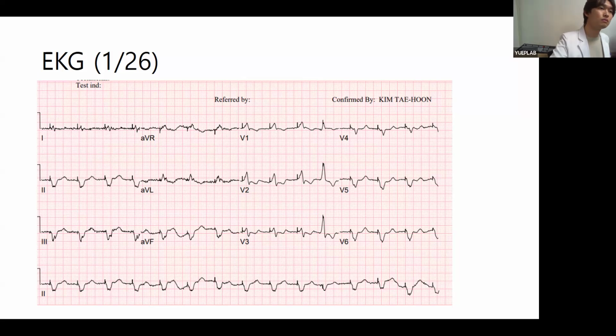Yeah, right. So I think that in patients with LBBB, which is a class 1 indication for BiV CRT, BiV CRT is still the answer. But we don't know in patients with AFib and in patients with non-LBBB. We don't have the best answer, because BiV CRT's response is not that good in that kind of patient. I think CSP will have some role in that kind of patient.